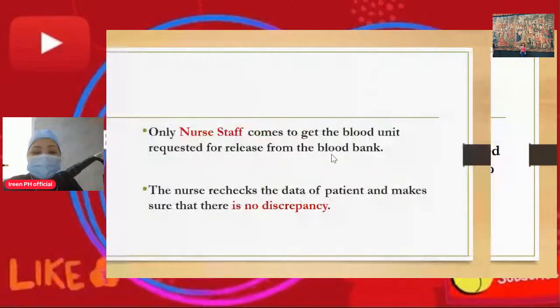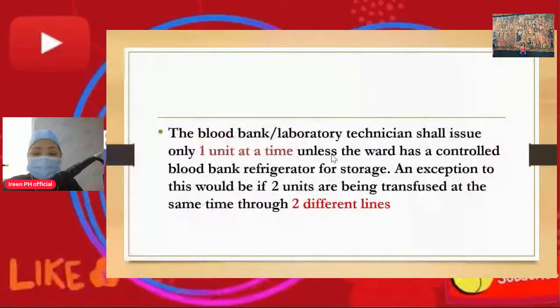Next, the blood bank laboratory technician shall issue only one unit at a time unless the ward has a controlled blood bank refrigerator for storage. An exception to this would be if two units are being transfused at the same time through two different lines.